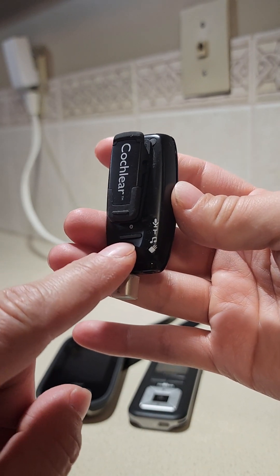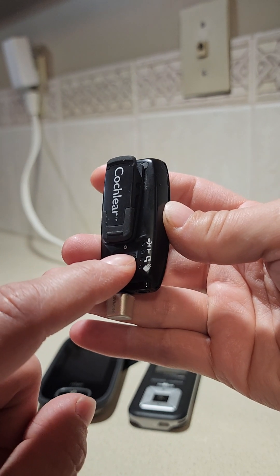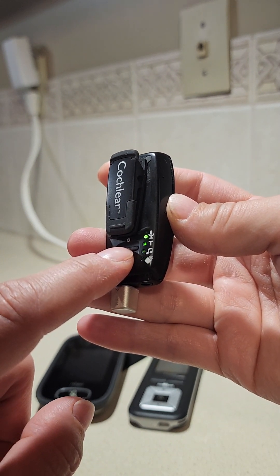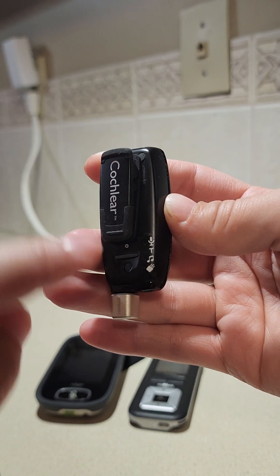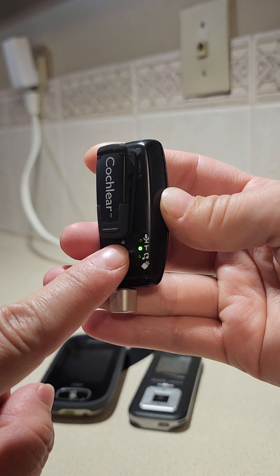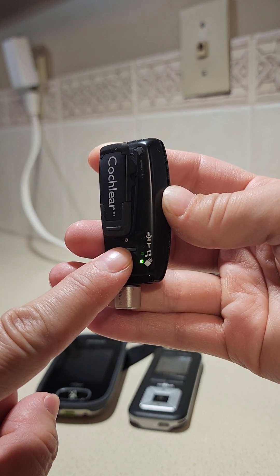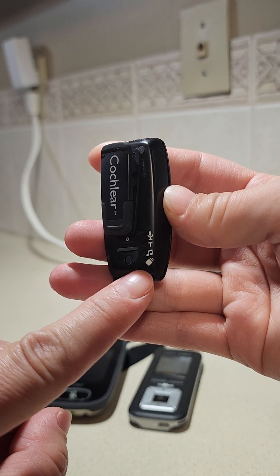If it doesn't turn green, press this button right here — it's the long gray one — and that will cycle through the options. That option is the microphone, the Mini Mic itself. The next option is a telecoil, which I don't have, and then there is the Roger system.